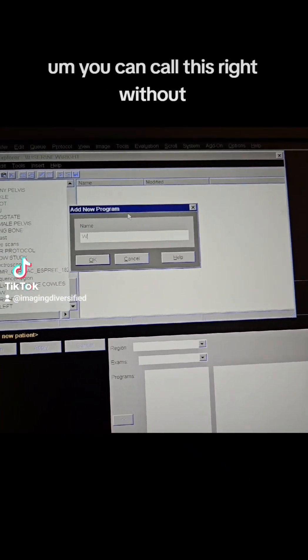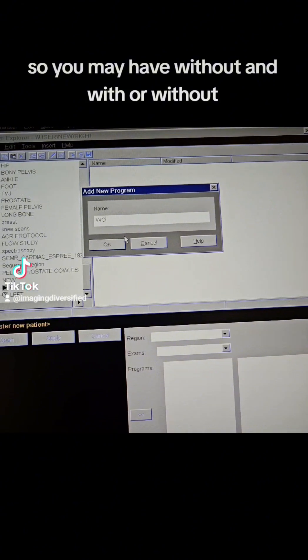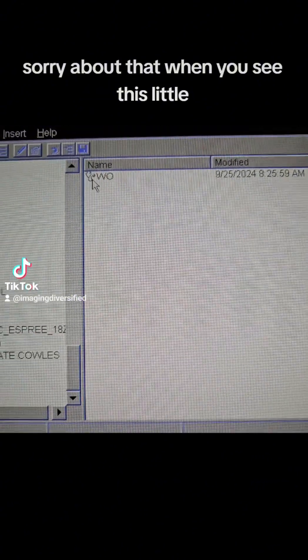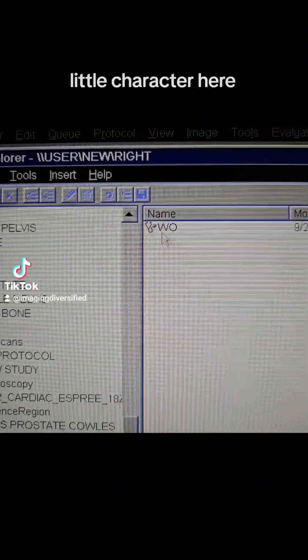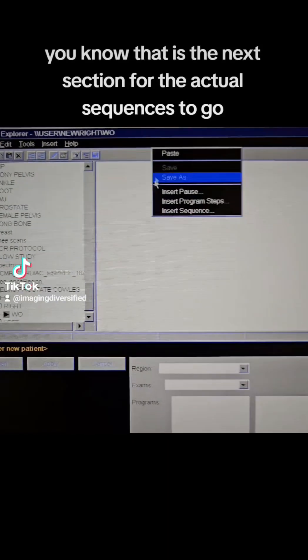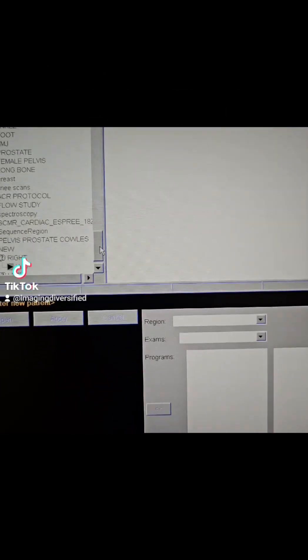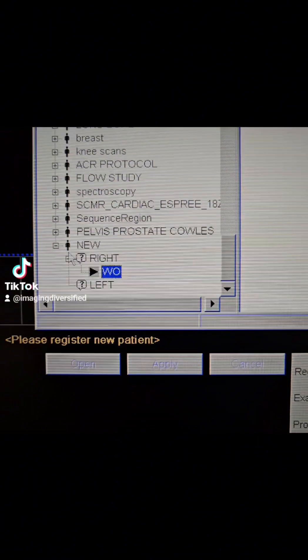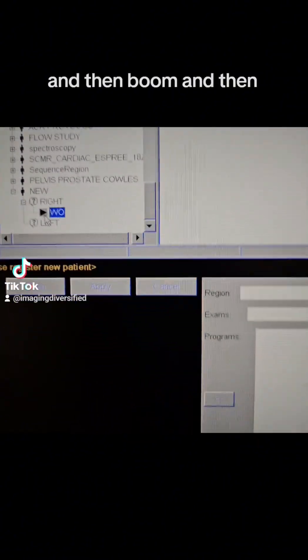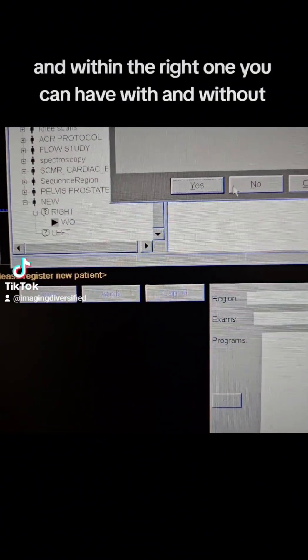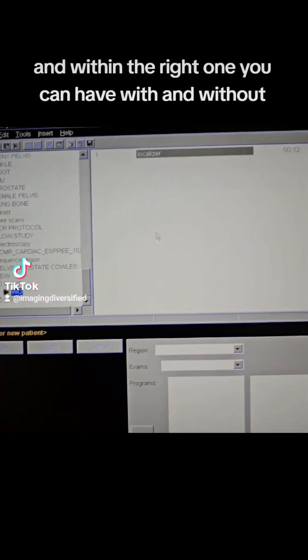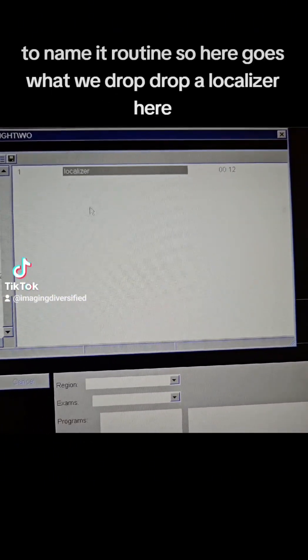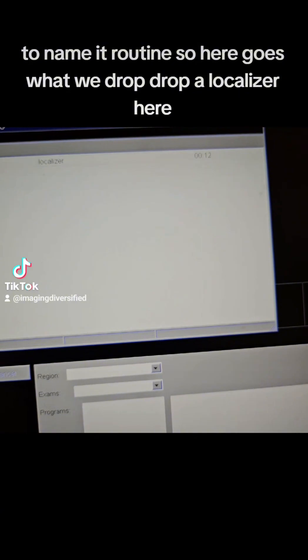You can call this right without, so you may have without and with. When you see this little character here, you know that is the next section for the actual sequences to go. So you have three, and then, of course, you can have right, and within the right one, you can have with and without, whatever you want to name it, routine. So here goes where we drop the localizer here.